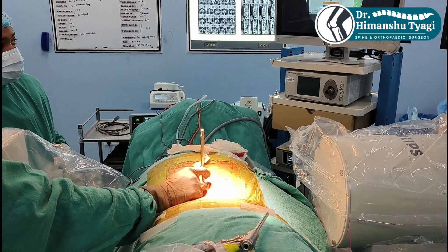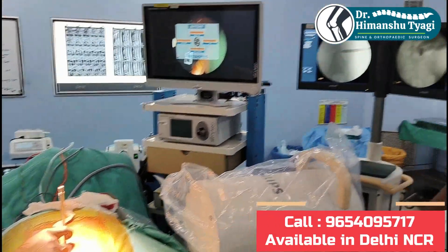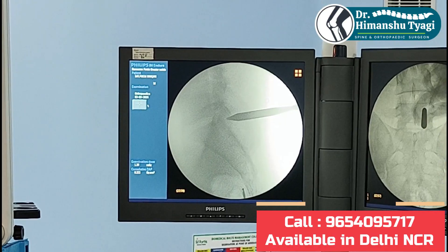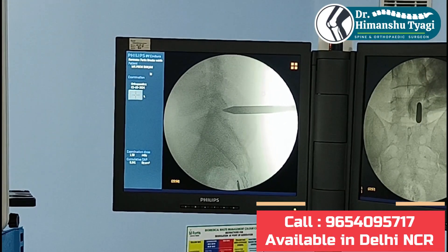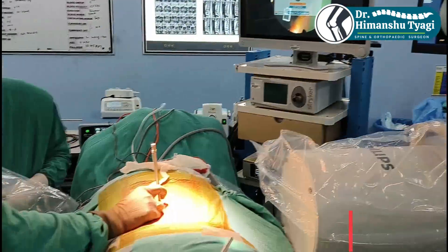We don't cut any muscle, we don't cut any bone. We put serial dilators and through that we make a tunnel or a track. We check the level again to confirm the level of surgery is correct before we put our endoscope through the track.